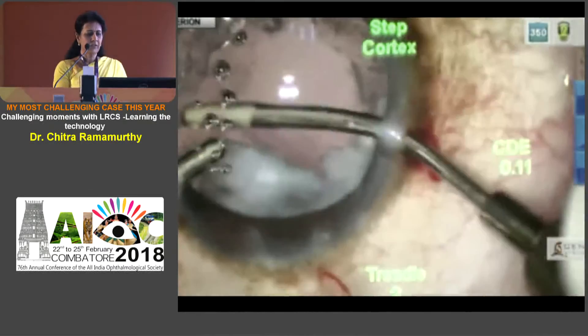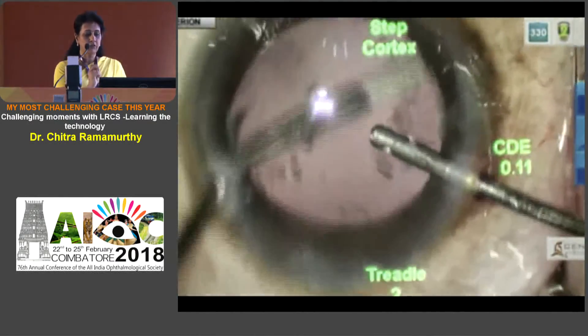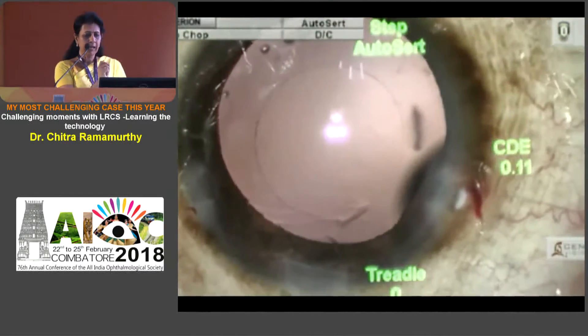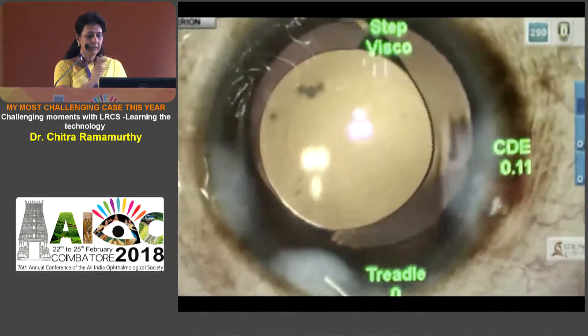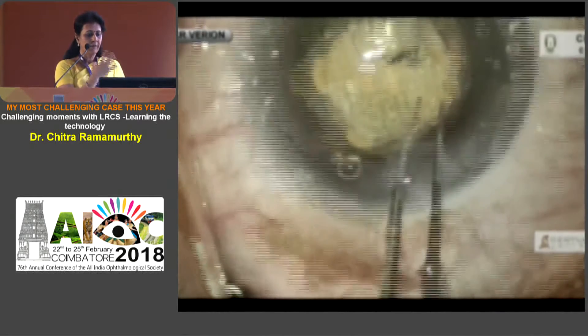As it goes on, it appears as if the rhexis is intact, but I need to be very careful because there could be areas where the tissue bridges may not have cut it, and there could be those tags or tears. But finally the surgery goes on well. The learning curve in a hypermature cataract is to create a deeper offset in the anterior capsule.